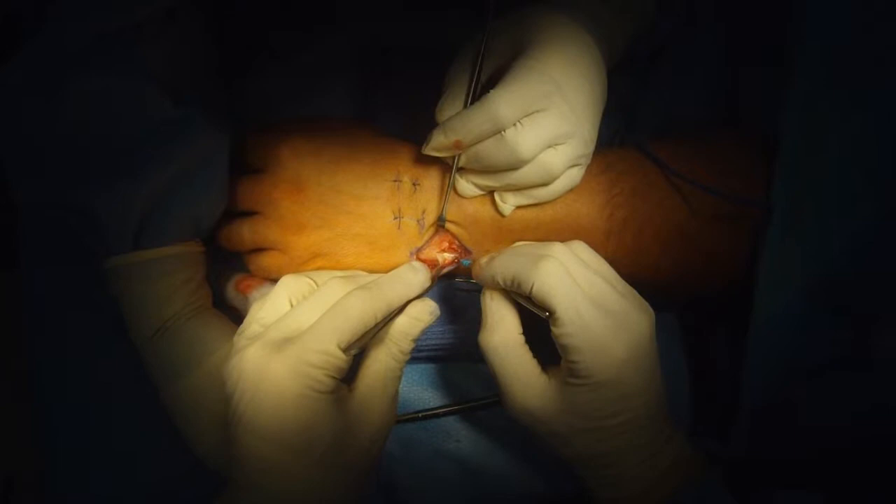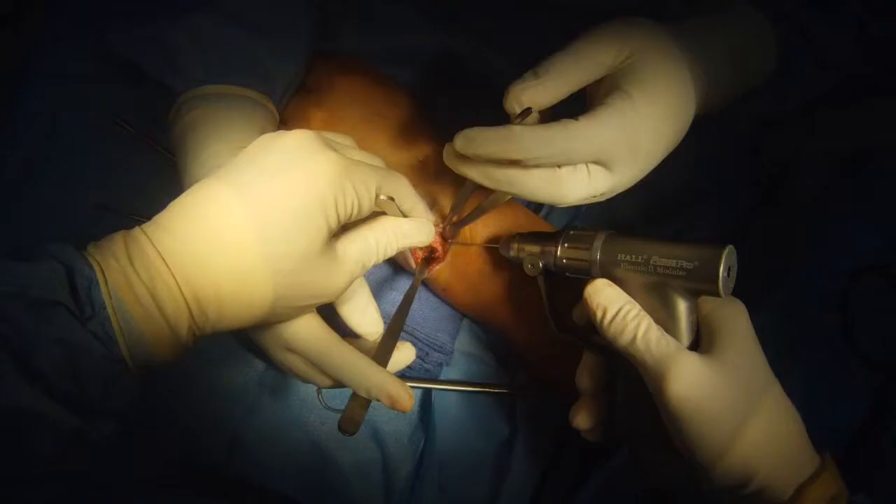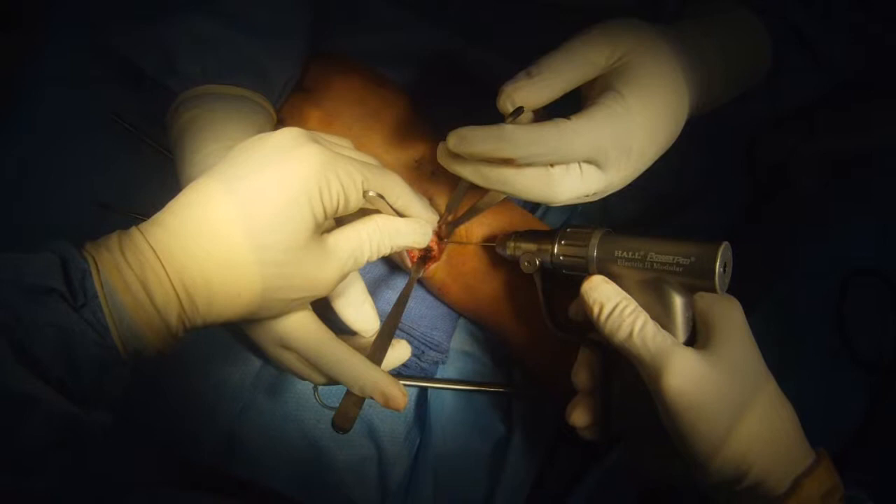Dissect down. Find a tendon and protect it so it doesn't come to harm. You can see four little stab wounds from a wrist arthroscopy that was done just before this open case.